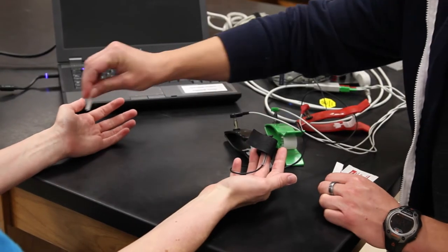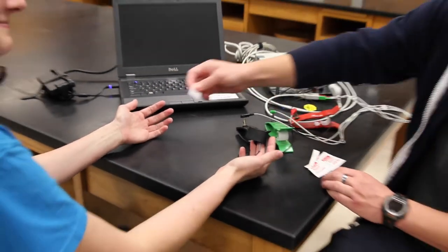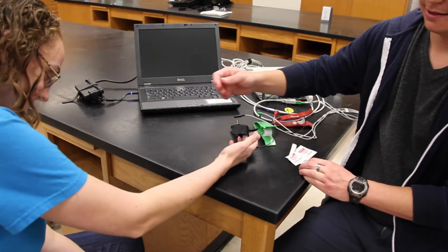Clean the skin where the electrodes will be placed with an alcohol prep pad. You should clean the subject's right wrist, left wrist, and right ankle.